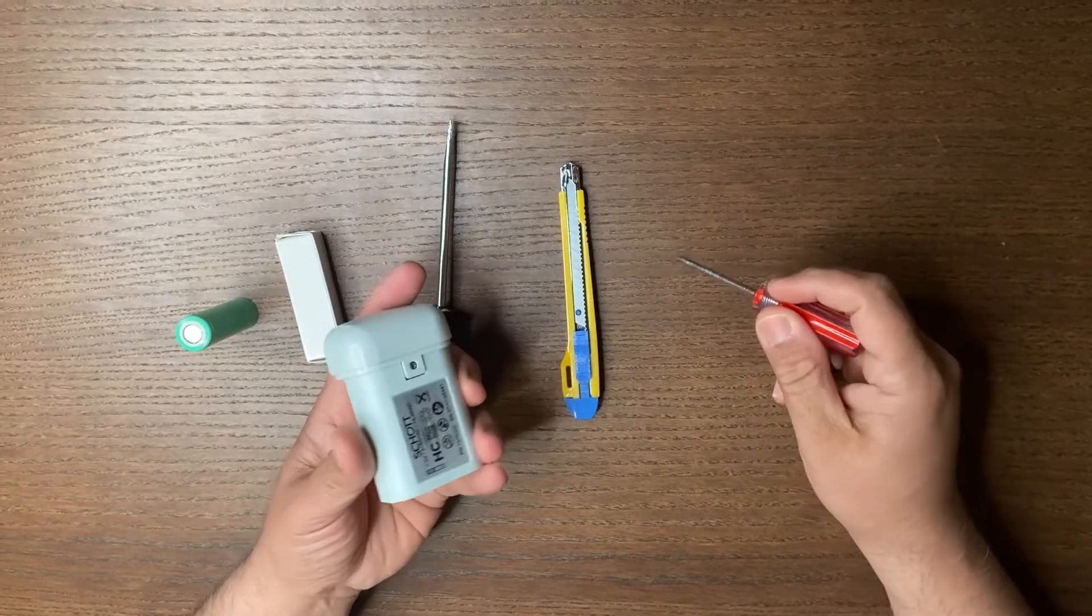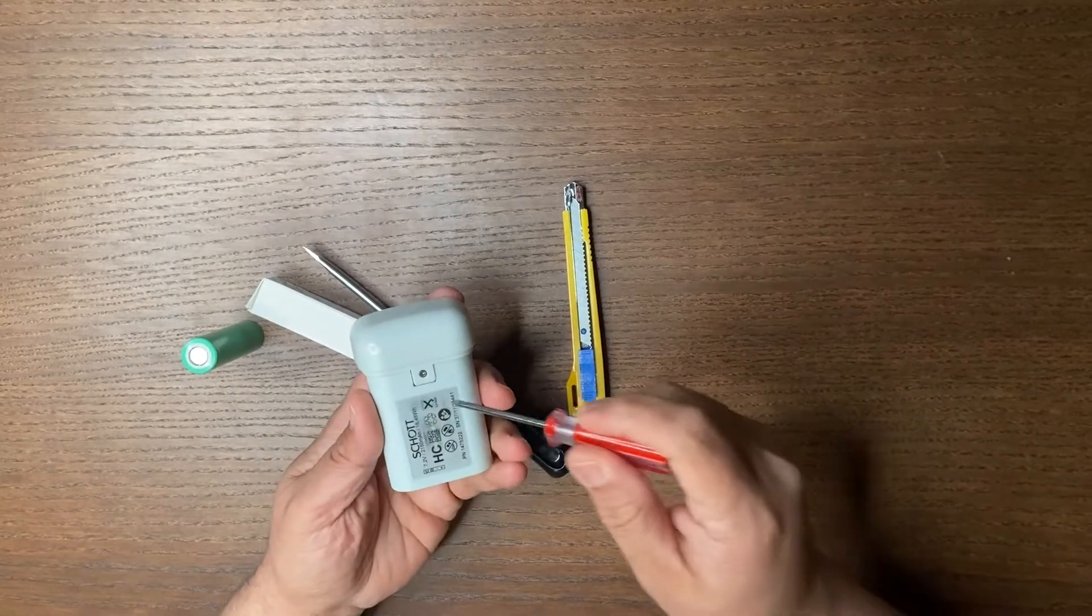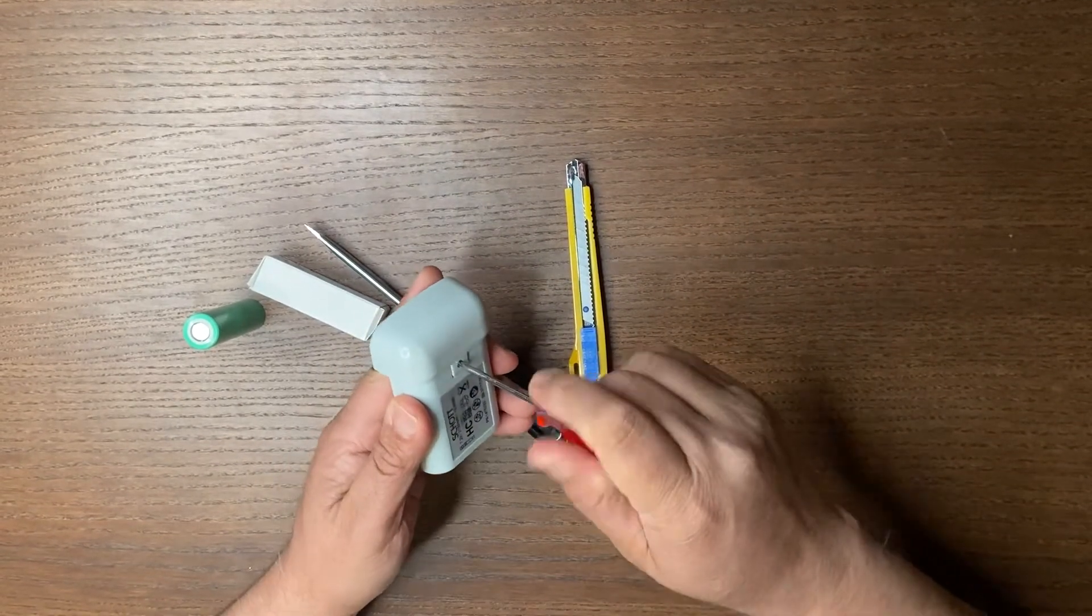This video shows how we can change the battery for Zeiss Loop. In Zeiss Loop, usually the battery comes with two screws.